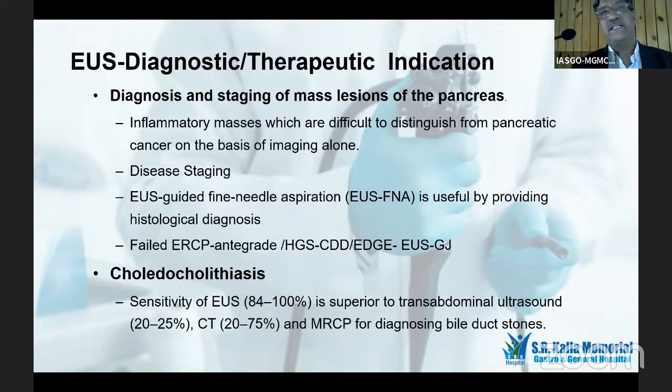As for the MRCP in the last presentation, which was such a beautiful presentation, we saw nice pictures. But in our unit now, henceforth, where there is biochemical abnormality and a dilated CBD with no obvious stone seen on ultrasound, we take these patients to EUS, because the lower one-third of the common bile duct, because of the gas in the duodenum, is difficult for ultrasound radiologists to visualize.